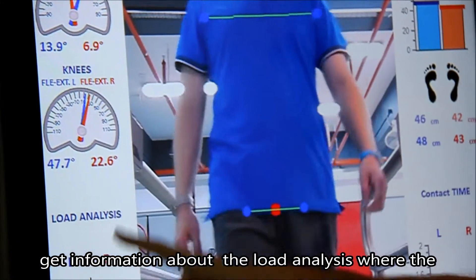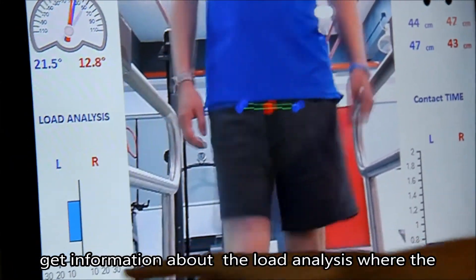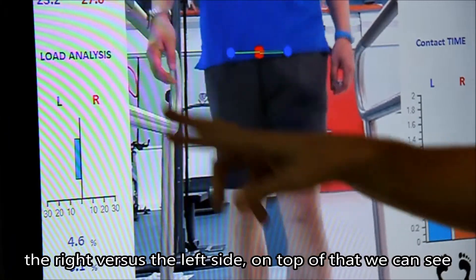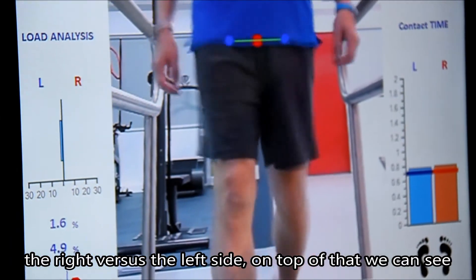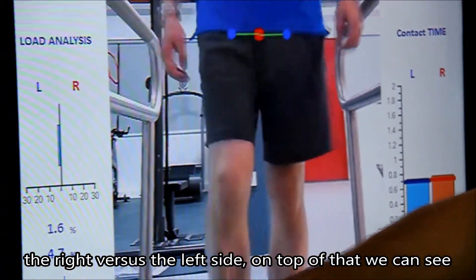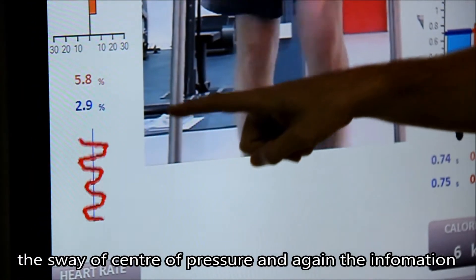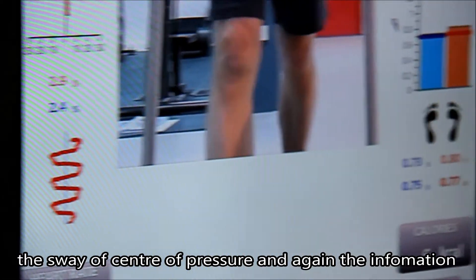We get information about a load analysis compared to the right leg versus the left side. On top of that, we can see the sway of the center of pressure.